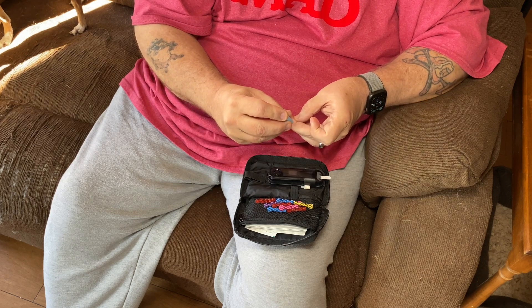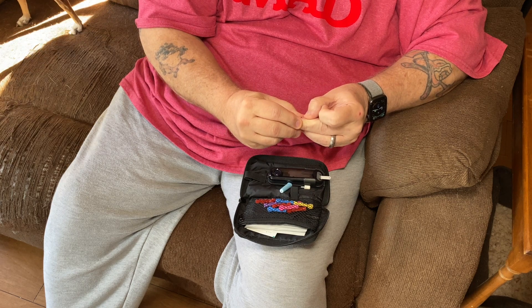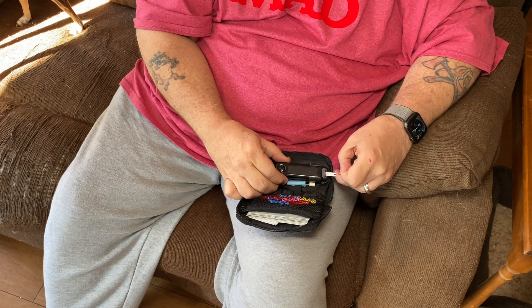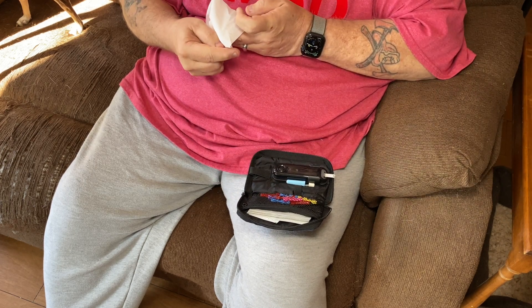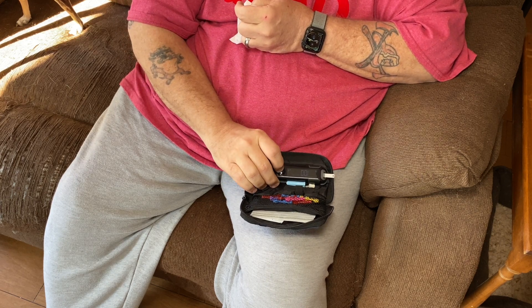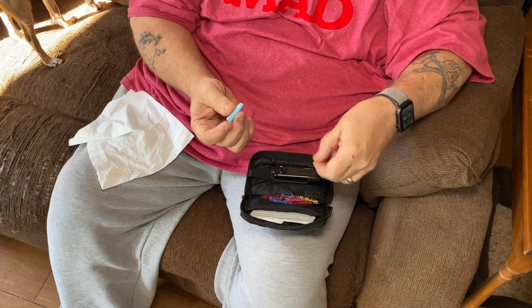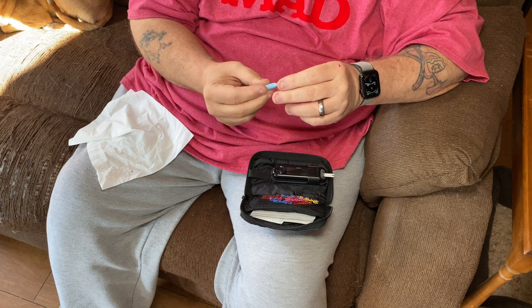All there is to using the PIP is you take the tip and turn it 360 degrees and it'll come off. Then just put it up against your skin and push. I really didn't feel virtually anything, and I'm getting a good blood drop. That was super easy and I really did not feel that at all — it was just the slightest touch. 100 is my sugar level, and it's before I eat.